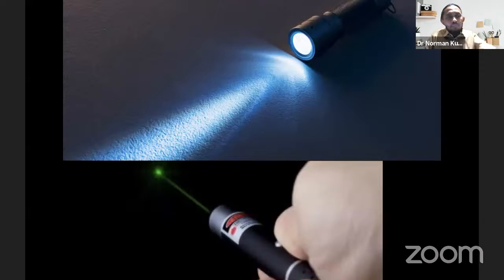As we can see, if we put some light here, going through the camera, the light gets more focused, going deeper and becoming smaller and focused. But if we go a farther distance from this area, the area gets wider. For example, my face: if I put it closer to my cheek, the laser is like a pointer, it's smaller. But if we go farther, the distance between the laser and the target, the effect will be wider. So it's the physical biointeraction of laser.